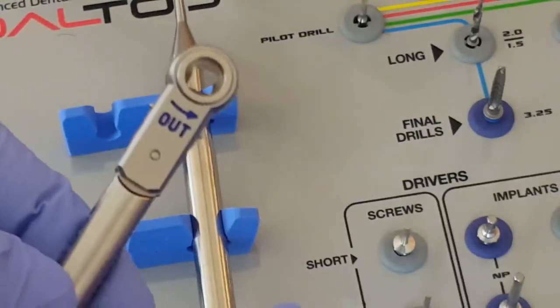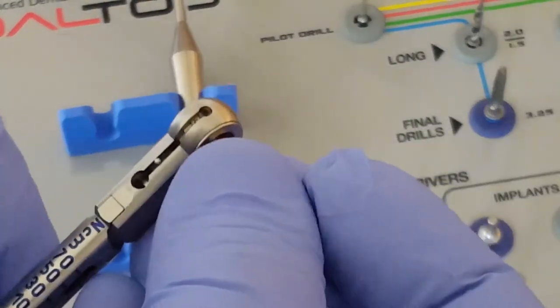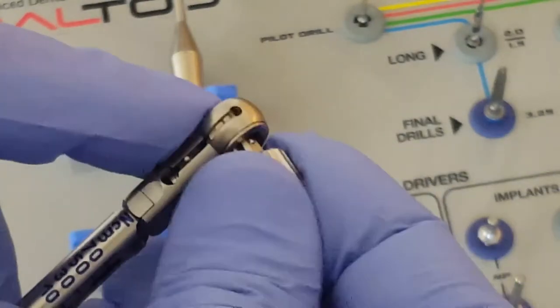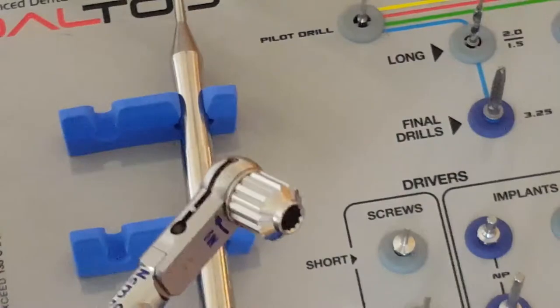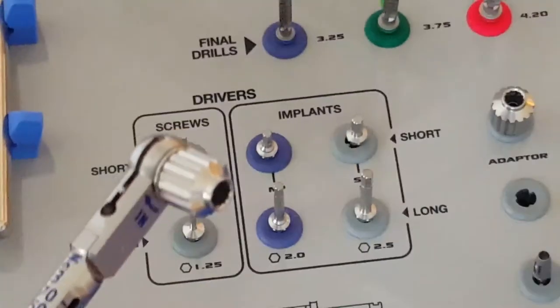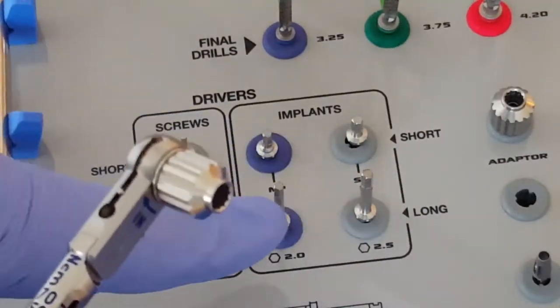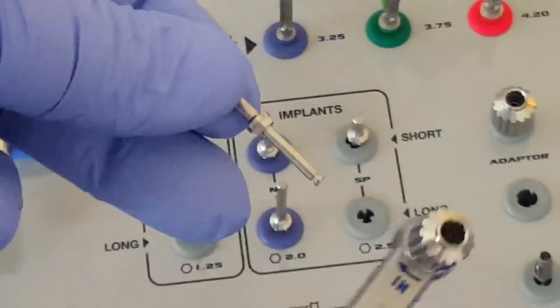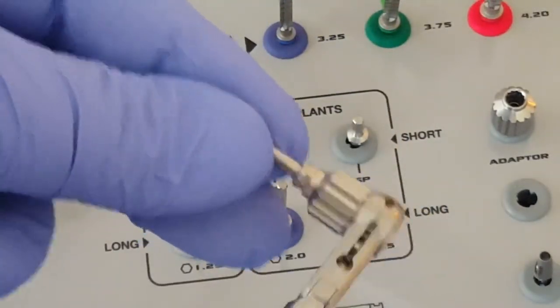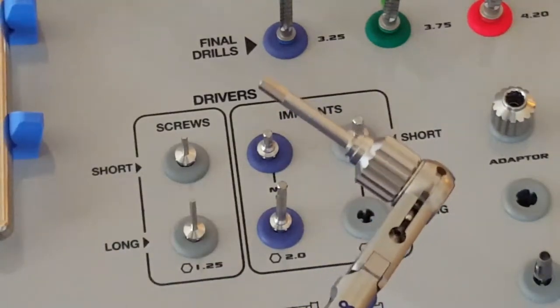one side says out. We insert the adapter into the side that says in. And then we pick and select the appropriate implant insertion key. So if it's a standard platform, we would take the long or the short, and insert that to complete the assembly.